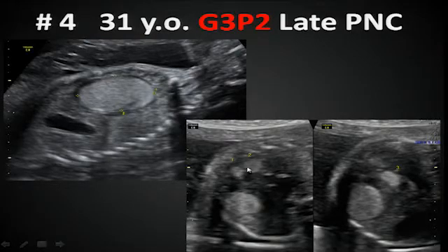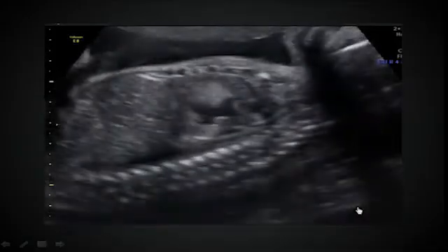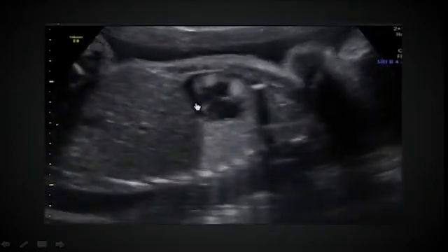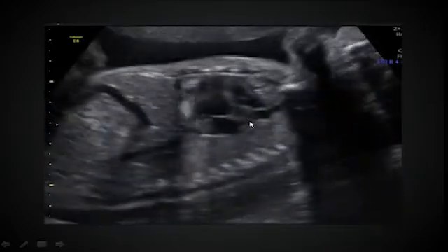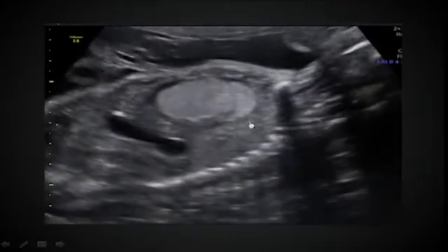And whenever you start seeing numbers, and you know there's more than one, so we're actually counting these little hyperechoic areas that we see within the chest. And this is looking at it in real time. So now we see it's not just in the lung, it's in the heart. So look at that big one. So there are actually 6 of these masses arising from different parts of the heart.